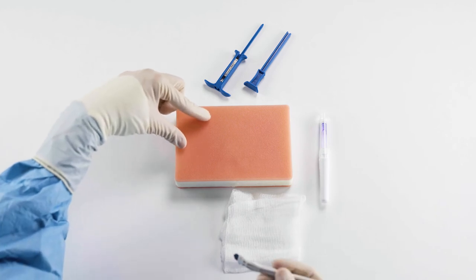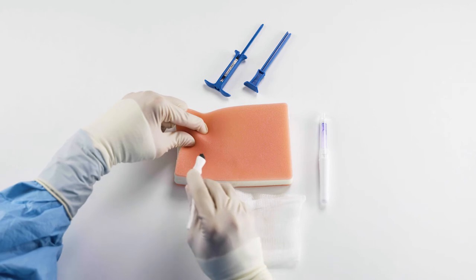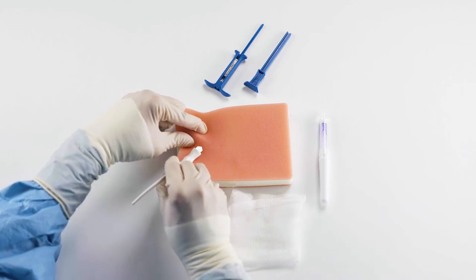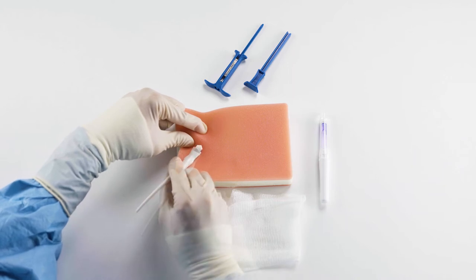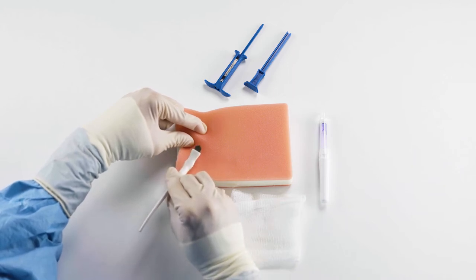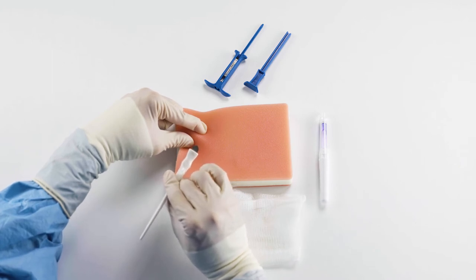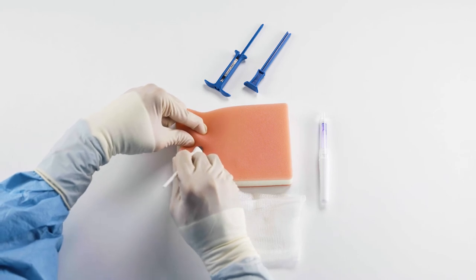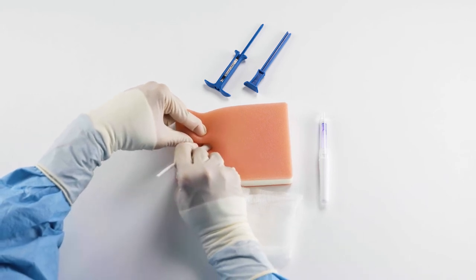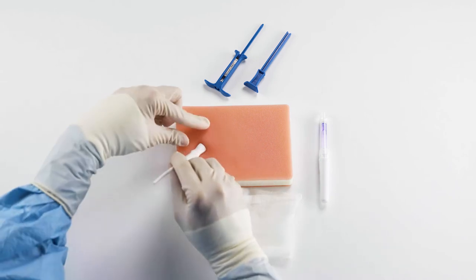With my left hand, I'm going to pinch the skin and raise it, and with my right hand — making sure that my fingers are not in the way — I'm going to use the puncture tool to make my incision. I recommend using this tool and not a scalpel, as this was designed to be the perfect length and width for this procedure. I'm going to tell my patient they're going to feel a little bit of pressure, and I'm going to push all the way in until the insertion tool stops the blade from going any further. Now I'm going to remove this.